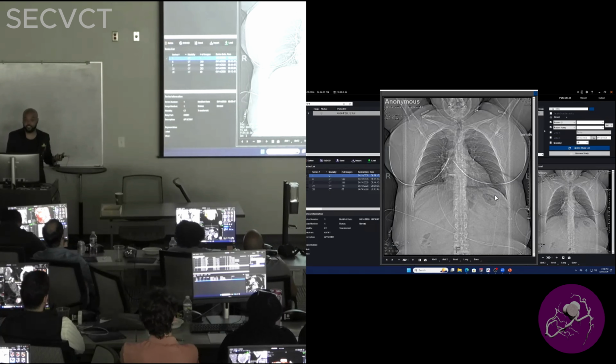They're a little bit heavier. So what are some things we want to talk about here? Basically, when you have a heavier patient, you're going to have a little bit more mass, especially if you have more of an apple shape rather than a pear shape. So you're going to get what? We're going to get noisy images, or we're going to have something like quantum mottle or photon starvation. Cool. And then we have the additional artifact of what?